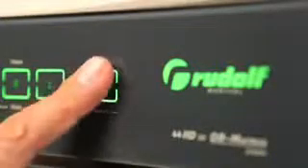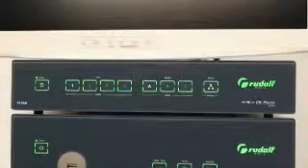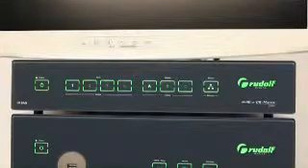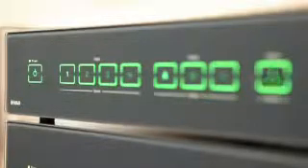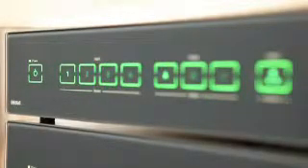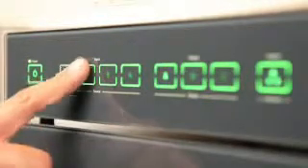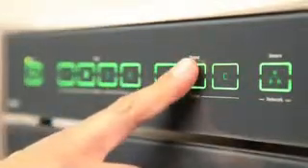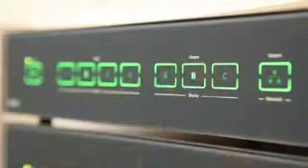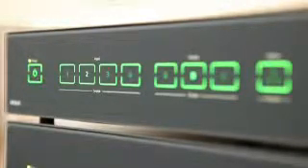By actuating the network key once, the broadcasting in the network stream is automatically blocked, and access to the operating theatre by unauthorized persons is thus prevented. The integrated safety concept of the OR Matrix HD ensures that the operating theatre team is always informed of the operations broadcast in the LAN. As such, for instance, after switching an input signal, for example routing the operating theatre ambience camera to monitor B, after about 5 seconds the device is automatically switched back to the input key assigned to the live stream.